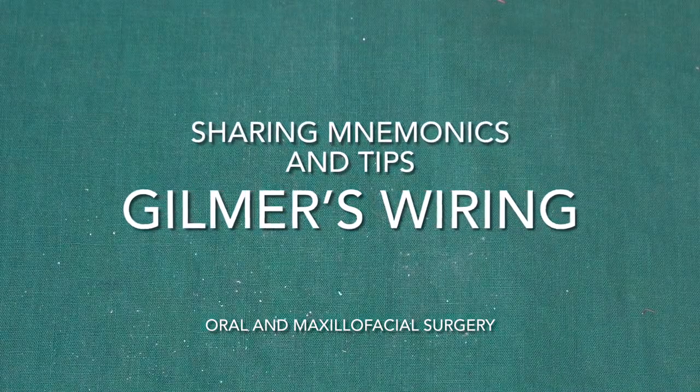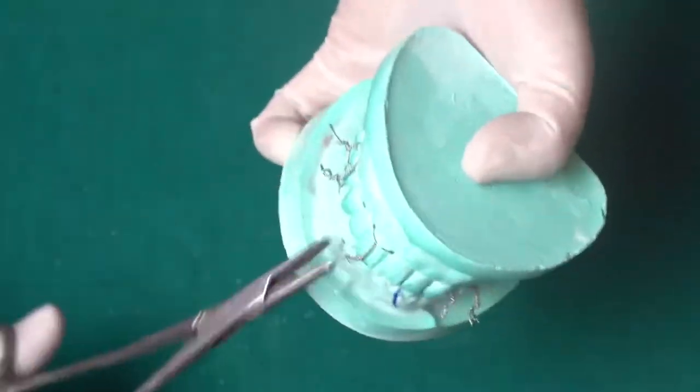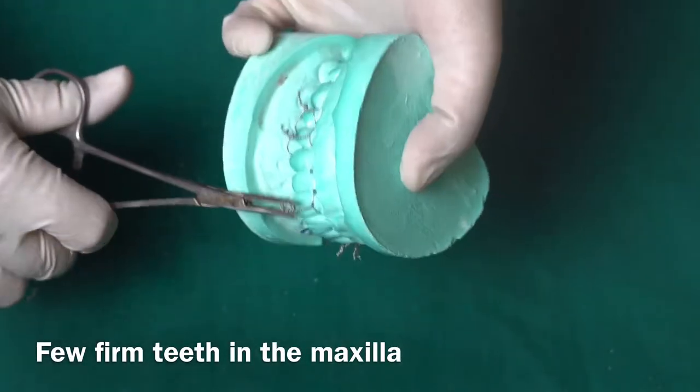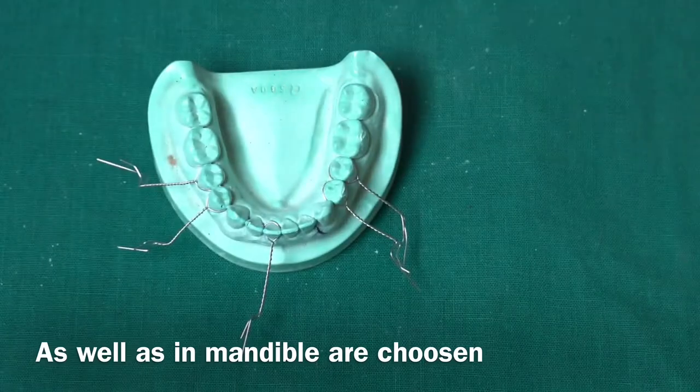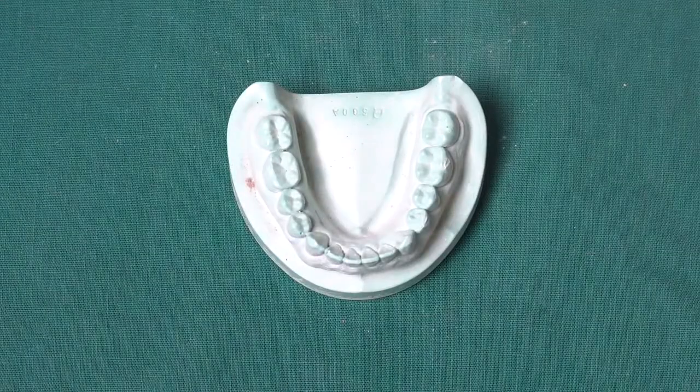Welcome back to the channel. Today's video is about Gilmer's wiring — a direct wiring method of intermaxillary fixation between the maxillary and mandibular teeth. A few firm teeth in the maxilla as well as in the mandible are chosen. This is the most common, simple, and practical method.